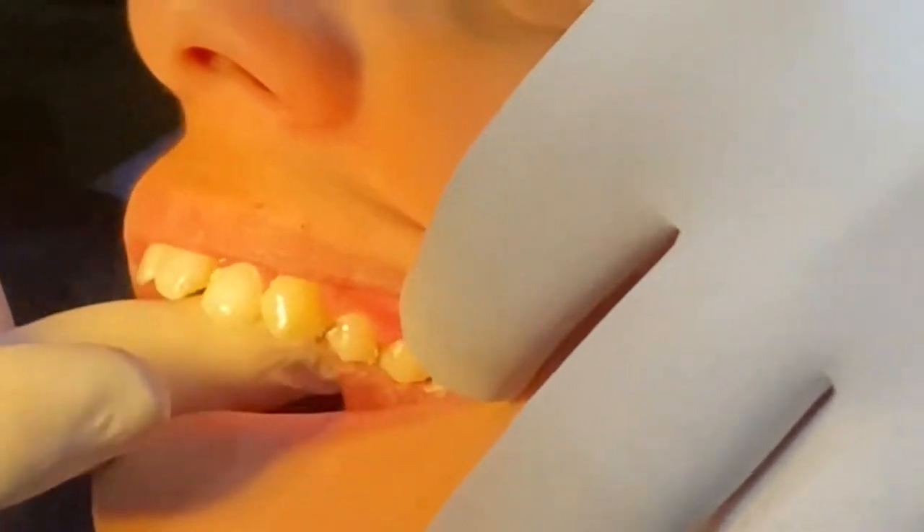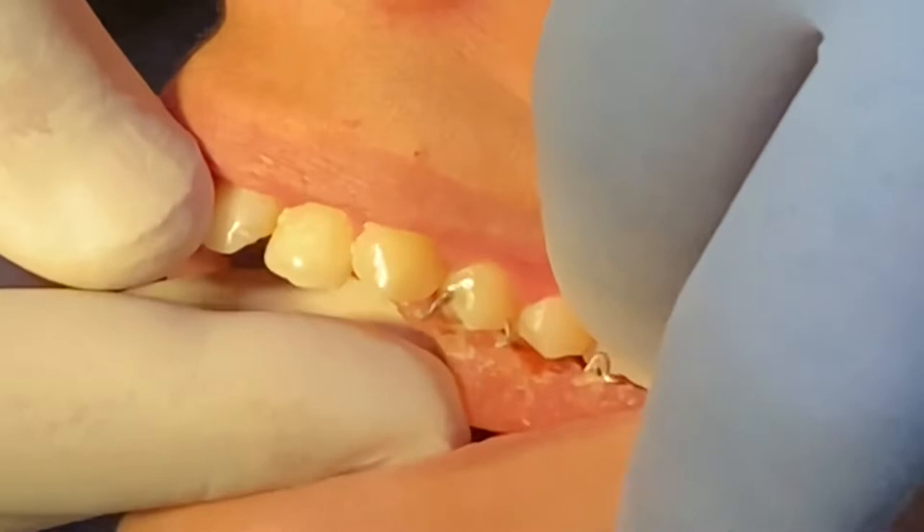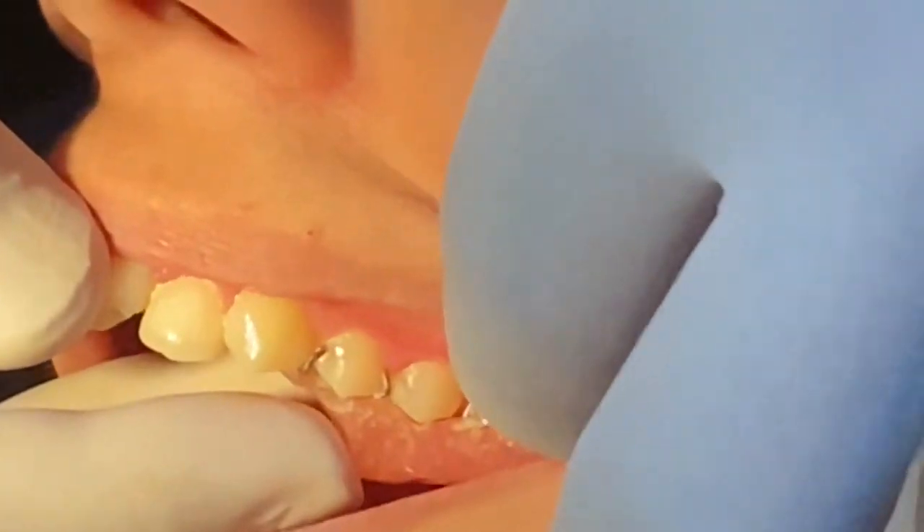Focus. So you would have some idea that after placing the tube, on insertion and removal, this is not interfering with the tube.